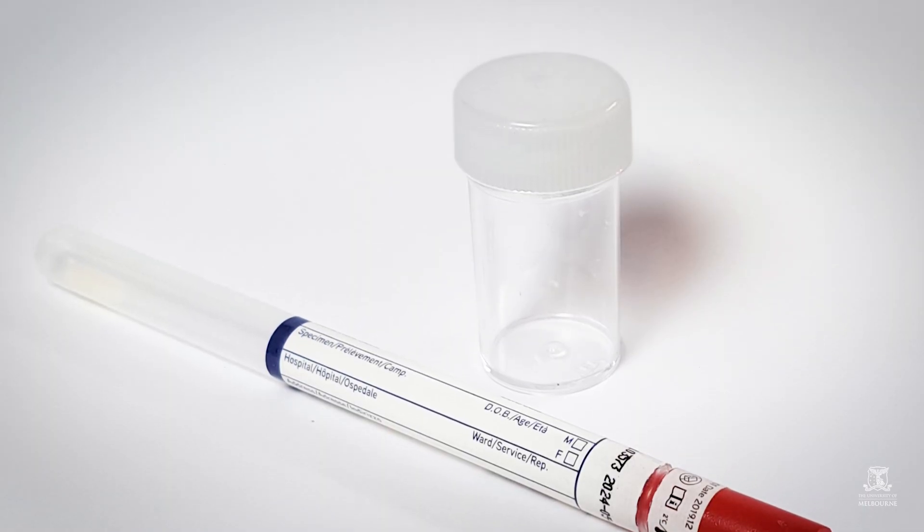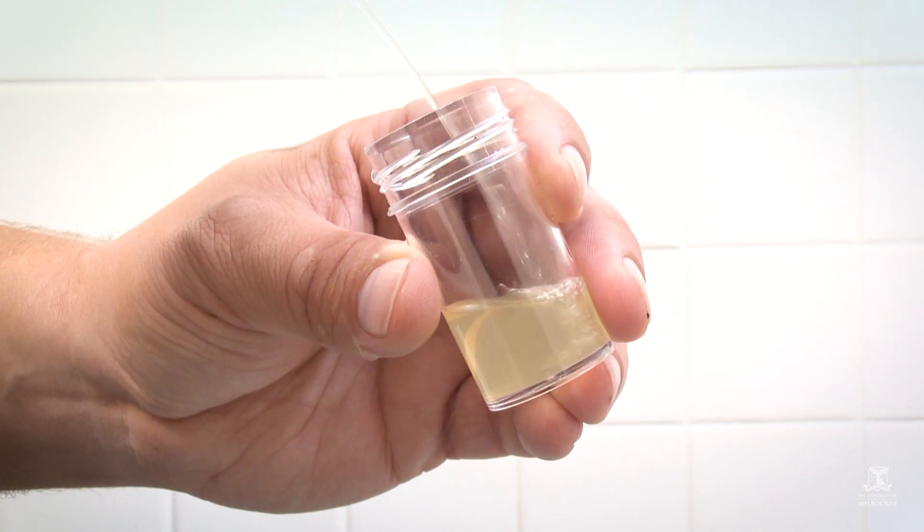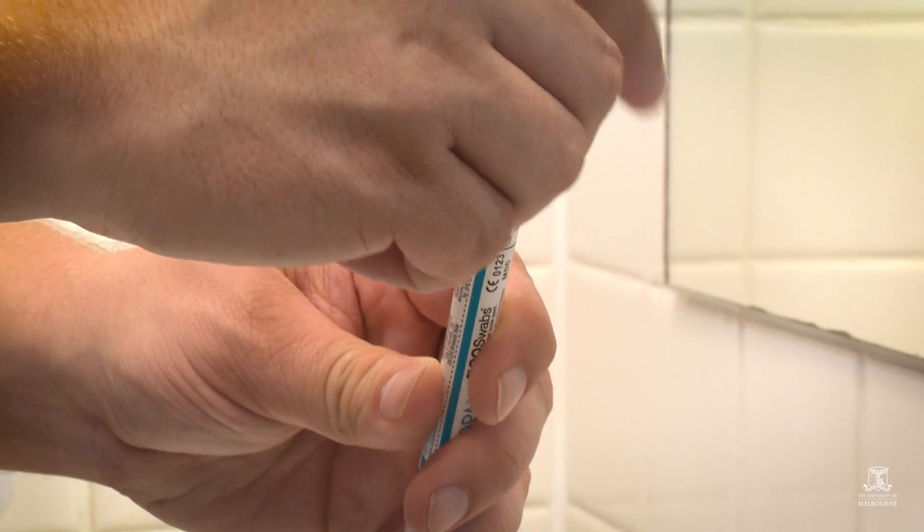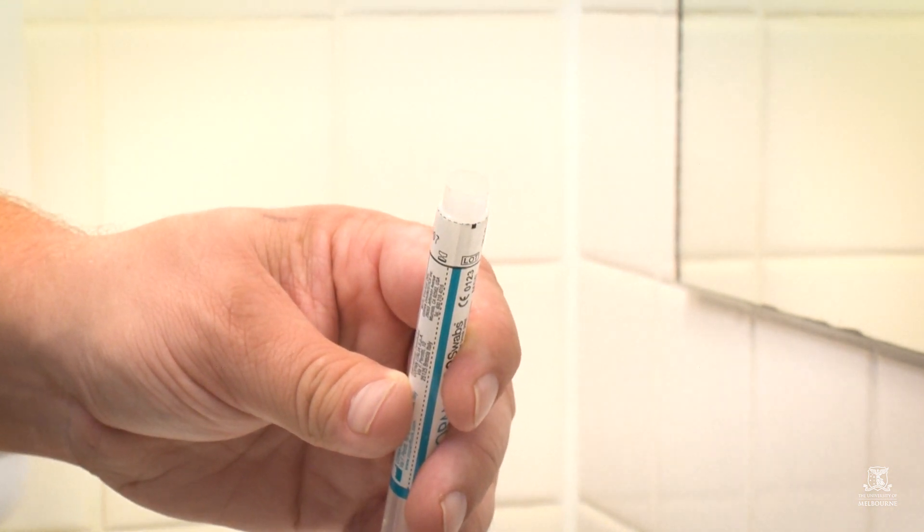Remove the white cap from the urine pot. Pass the first part of your urine into the urine pot, then finish peeing in the toilet. Twist and pull the red cap off the swab and remove it from the plastic tube.